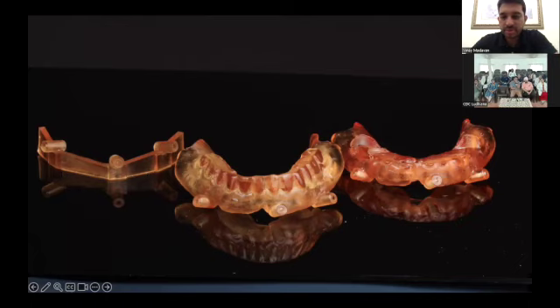And once that is all completed and recontoured, this is the third guide, which sits in the same locations where you had your anchor pins. And this has the openings for your implant, and you can go ahead and place your implant.